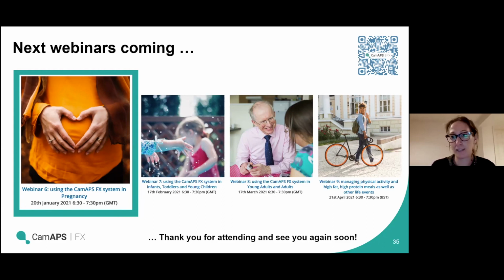I think if it's for something that's happening every day, like activity, I would probably preferentially use ease off. I think it's probably a bit more dynamic than changing the personal glucose target. And it raises it higher and makes the delivery less aggressive. So for day-to-day activities, I'd be using ease off, and it is much more accessible on the app as well. It's right in front of you on the home screen to encourage that.